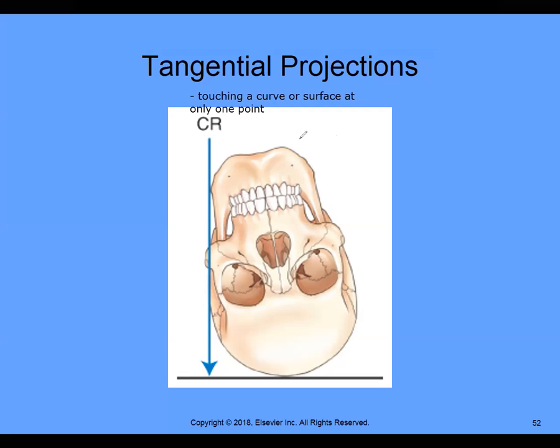Let's pretend that this is my patient here. And they're lying down recumbent, facing up. And they have their knees bent on the table. These are their feet over here. Okay. Now, in the knees, we have some small bones, right, that are called patellas on both knees. We have one on each side.